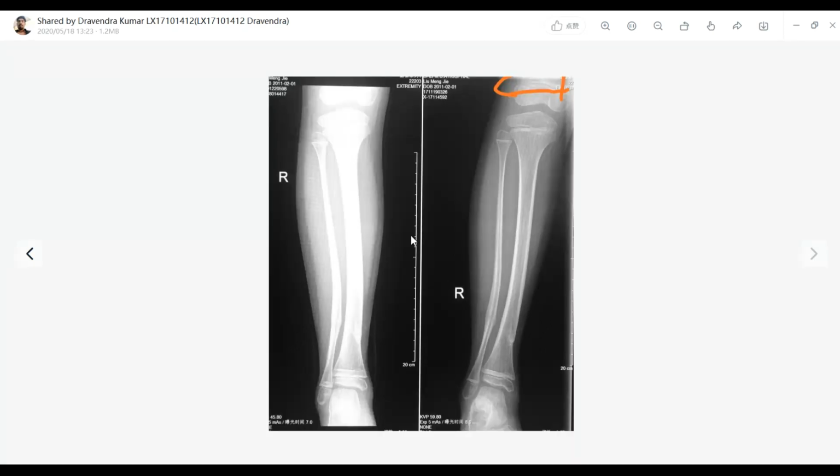Yes, I know the diagnosis here. I came to understand that this is a fracture. So I'm looking at it in one view. Of course, I will do the same thing in the lateral view also, but still, here I am comparing with the older film. So this is the older film.